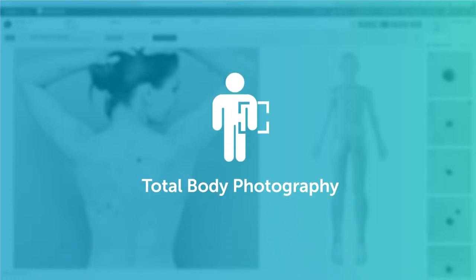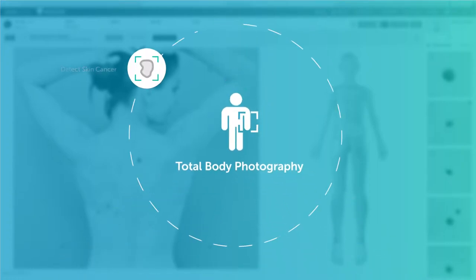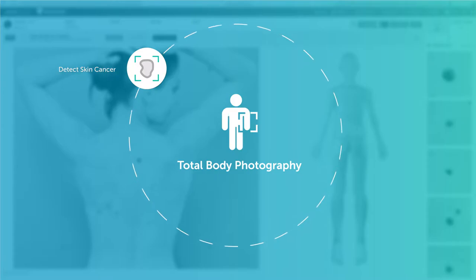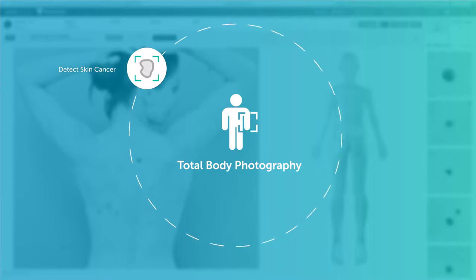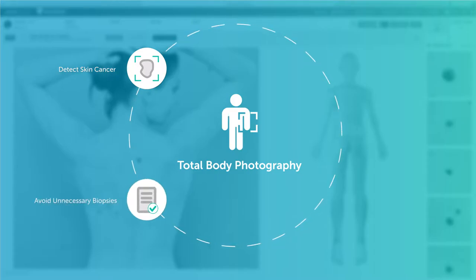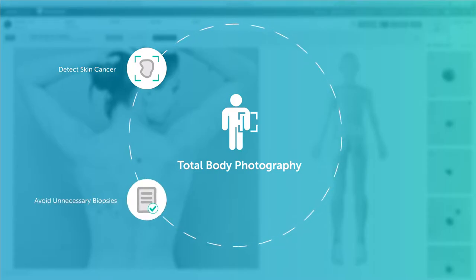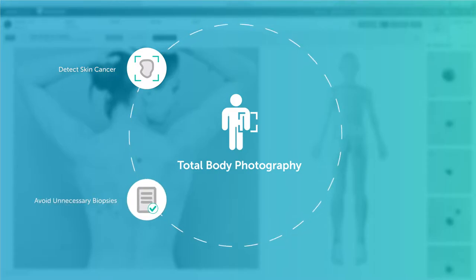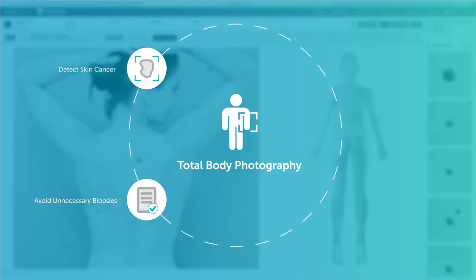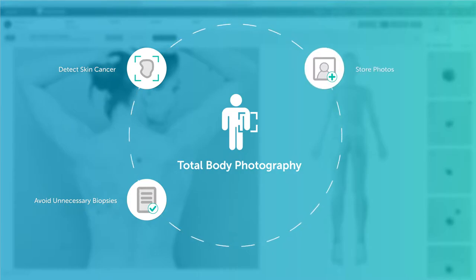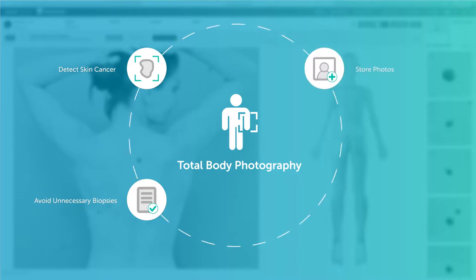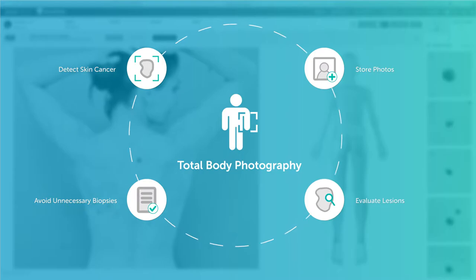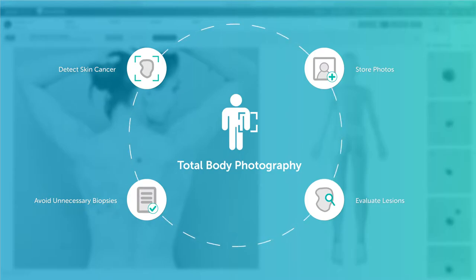Total Body Photography assists in the early detection of skin cancer and is valuable for avoiding unnecessary biopsies. It allows the capturing and analyzing of total body images by storing photos of different body parts, and supports you in detecting any new or changing lesions.